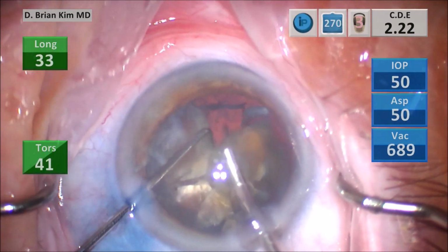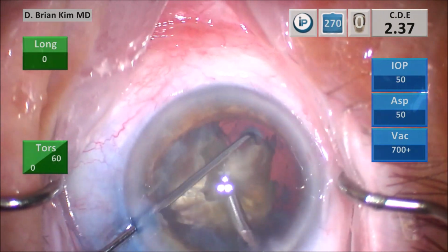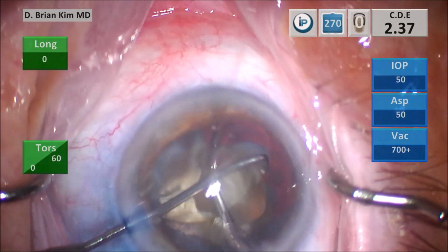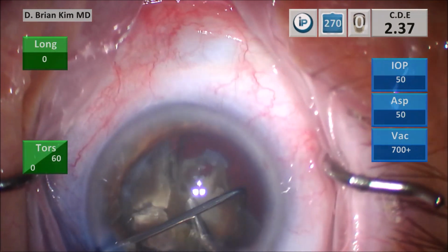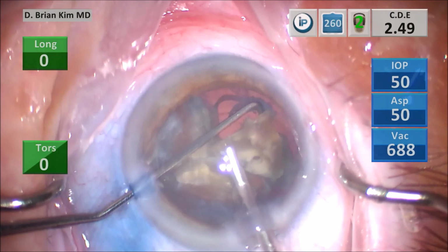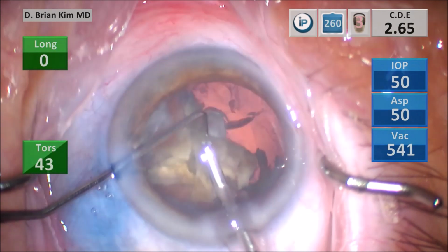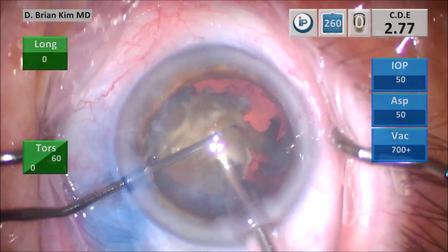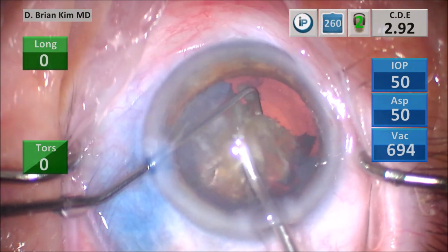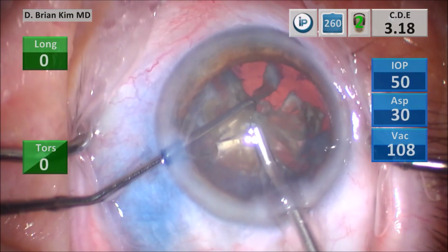So the lens piece kind of turned, and so that's why I'm actually removing first the outer segments of that fragment, because the outer segments kind of presented itself first as the lens piece tumbled. So I'm just trying to chop it little by little, and as I do this, I'm able to get around the girth of the lens piece and then chopping it again as I go here. Again, by doing it this way, I'm really using a lot less ultrasonic energy, and I do feel like this is really safer as far as protecting myself from the posterior capsule as well as protecting the cornea.